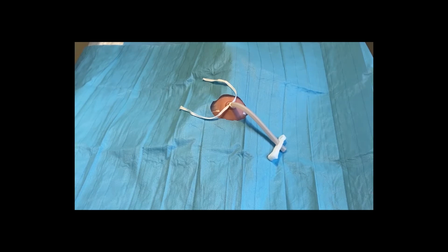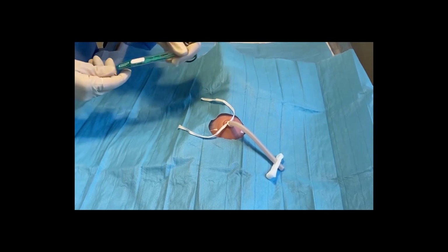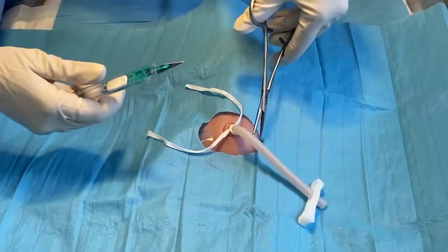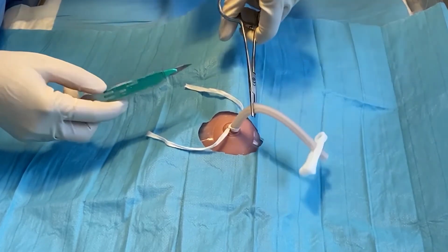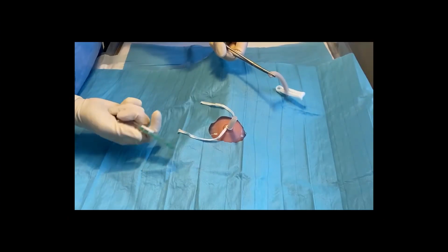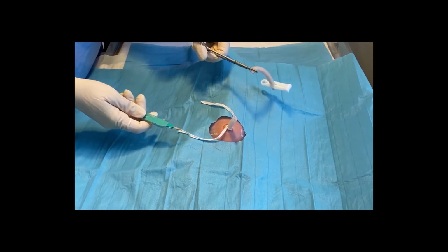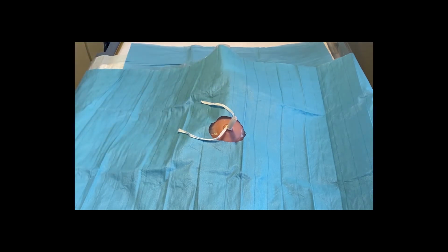We're now going to cut the cord, and you tend to want to do this about 2 centimetres from the skin. So first of all, clamp, and then with a single motion away from yourself, you want to cut the cord with one seamless motion. You don't want to be sawing, as that can damage the vessel walls and make it harder to insert the lines. So once you've cut, if there's any oozing, you can just dab.